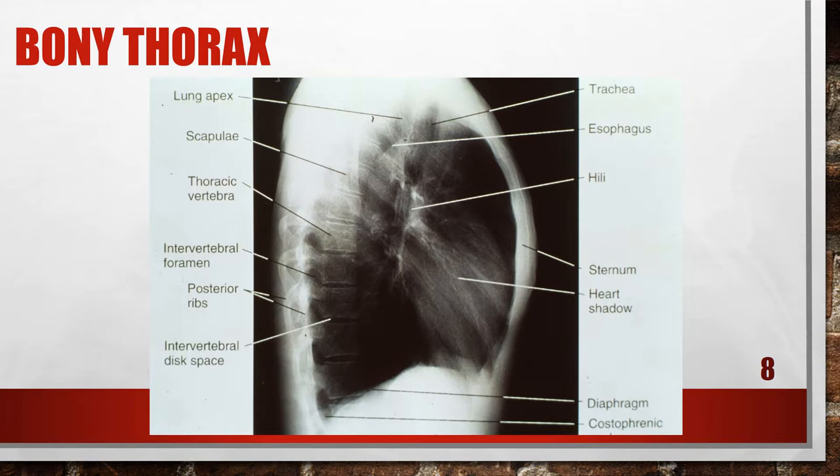I always take a look at the PA chest before I go to the lateral because I want to see if the patient has scoliosis. This patient does not have scoliosis — this is an accurately positioned lateral chest x-ray. But if they did have scoliosis, I would want to make sure that the sternum was lateral and I wouldn't worry so much about the posterior ribs. I want to make sure that I have the apices on, the bases on, and the costophrenic angle on.